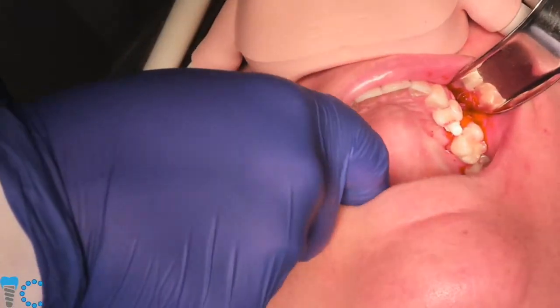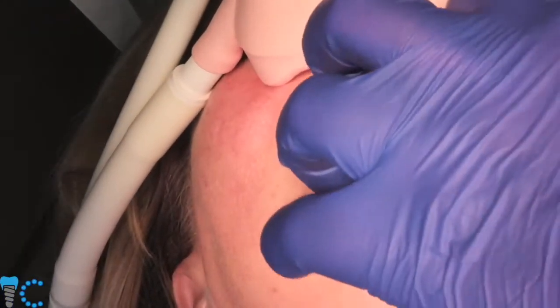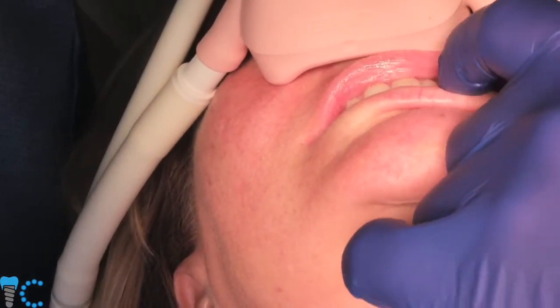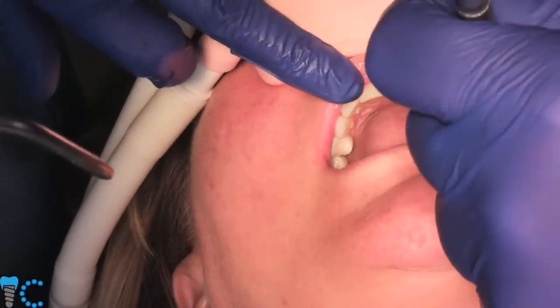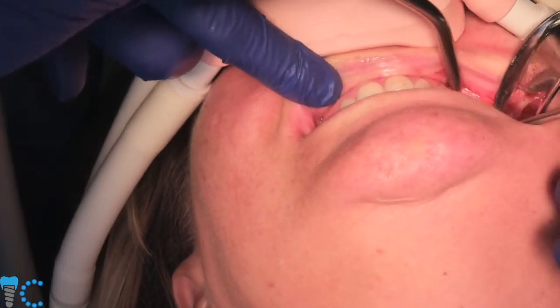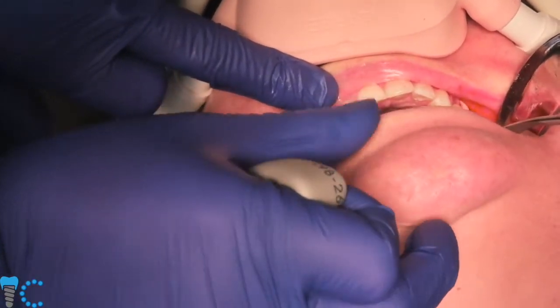There's our straight restorative abutment. Take the bite block out, have the patient close down. Beautiful. Good patient. Close down one more time for me. Okay, let's see. Get another instrument here. There we go. Close down for us one more time. And then there's our placement. Oh, can you open up a little bit for us? There we go.